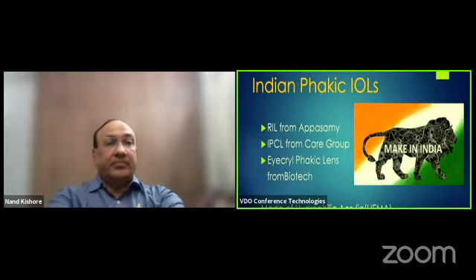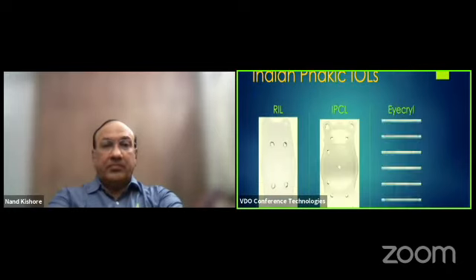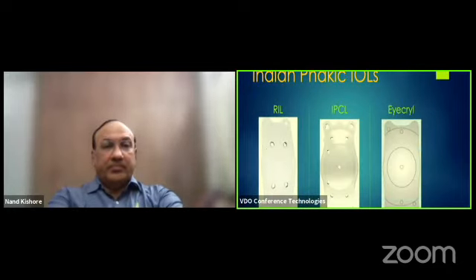Other options are Indian phakic IOLs. They are from Appasamy, Care Group, and Biotech. All these lenses are made up of hydrophilic acrylic. They look like this. The orientation marks for the Indian lens are like ICL only.